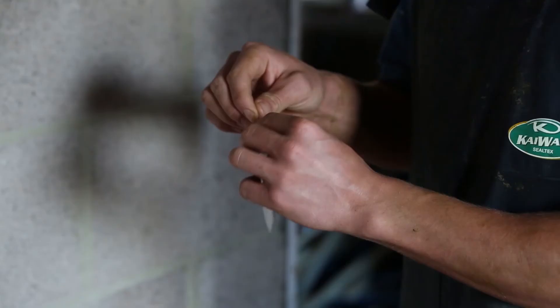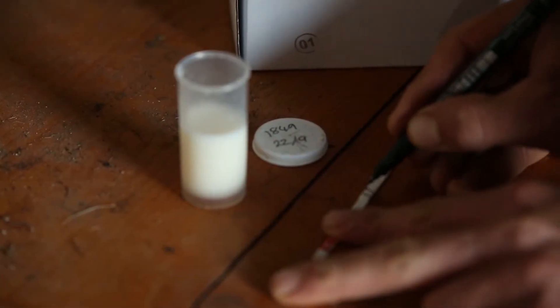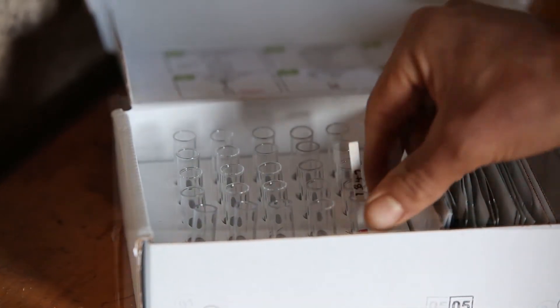Open a packet at the notches and remove the stick, taking care not to bend it. Write the cow number and date on the white label. Then, with the arrows pointing down, put the stick in the test tube.